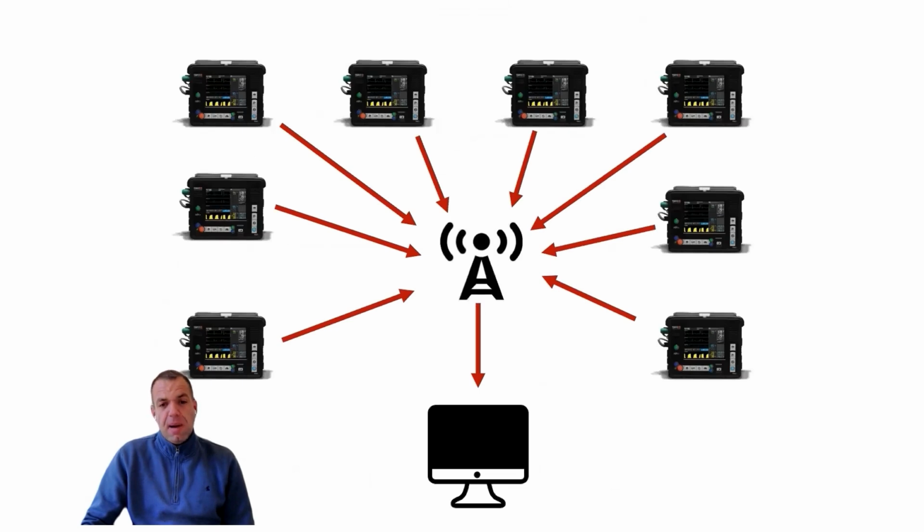And where this can be particularly powerful is if you have lots and lots of monitors, all sending in quality data to one central point. So when I started doing this work, I literally ran around with a USB cable trying to download resuscitation data from every monitor I could get my hands on after cardiac arrest. It's obviously not going to work, particularly over large geographical areas like Australasia. But because monitors are now connected, the Tempus is connected to the cellular network, you can beam in not just physiology data, but also resuscitation quality data, for example. That can be held in an ambulance computer, someone can review it, and then it can be fed back to those crews, which is really important for them to allow them to improve.